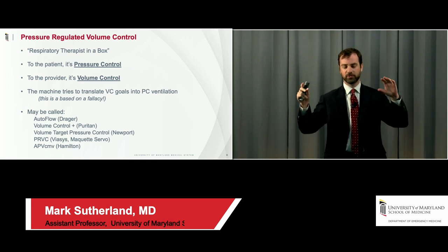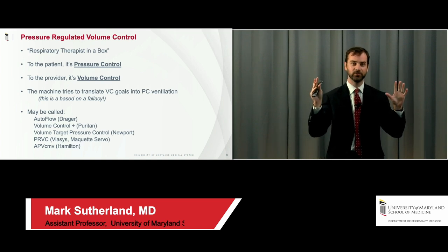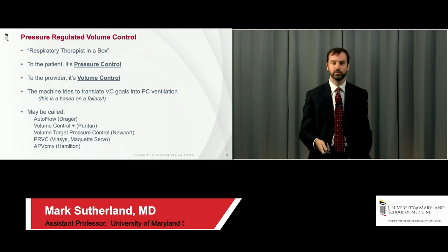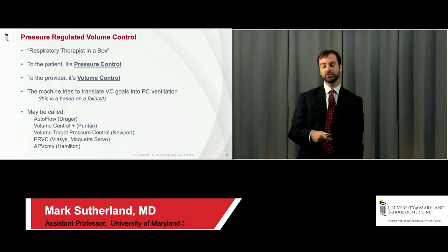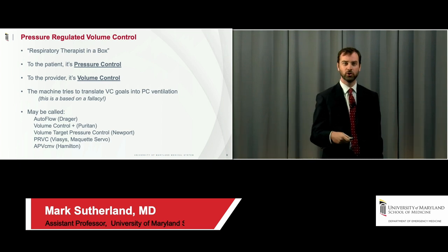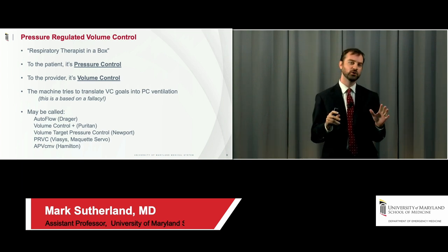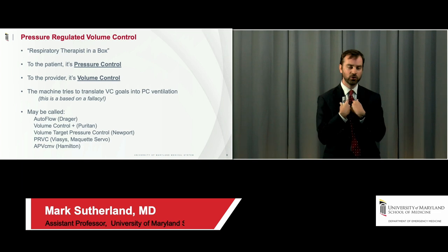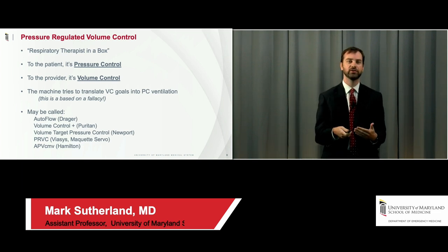And so for any of you sitting there listening to that, you might be thinking, well, that doesn't make sense. Those two are discordant concepts. And actually, that's absolutely true. By definition, you can't control volume and pressure at the same time unless you have control of the patient's compliance, which you don't. And so, therefore, what the machine is doing is it's trying to use guesswork, essentially, to convert my goals as the provider for volume control into pressure control-based breaths for the patient.